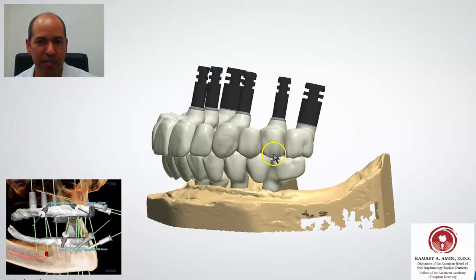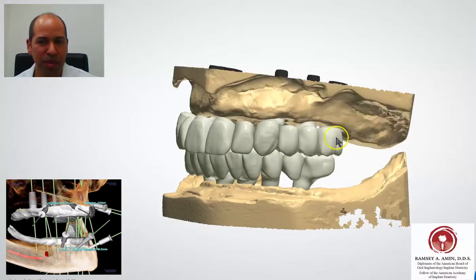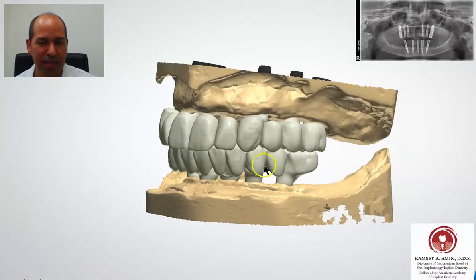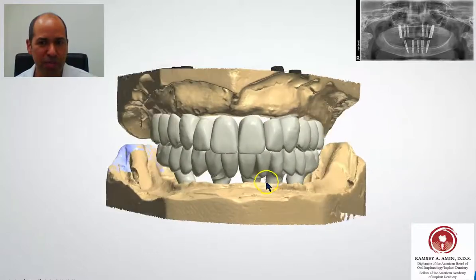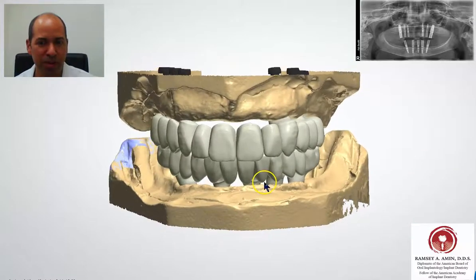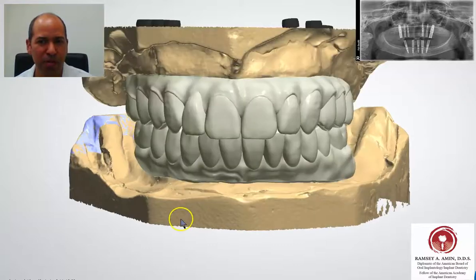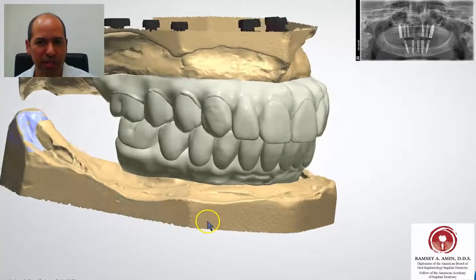She has a very big overbite. So in this virtual planning stage, my lab technician and I are going through each phase of treatment, figuring out where the center of her teeth are, how far forward they should be, and what the gums should look like.